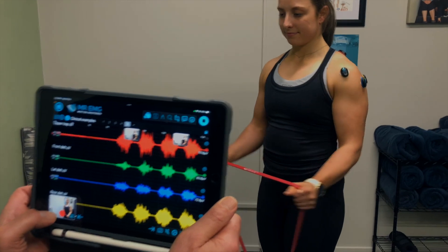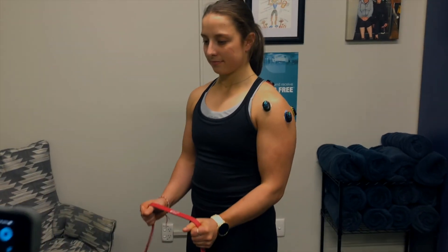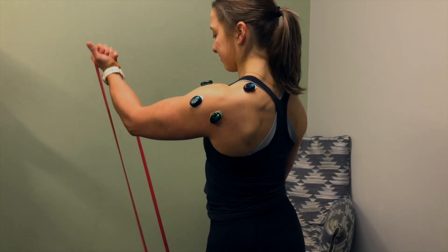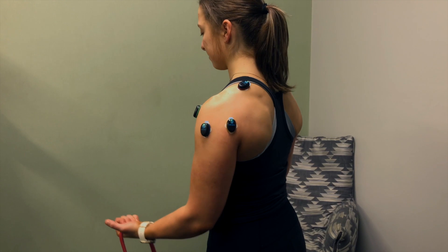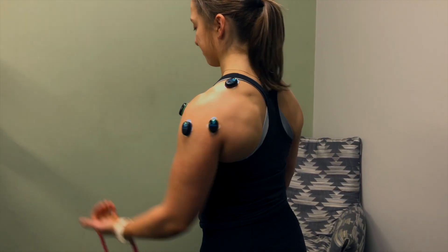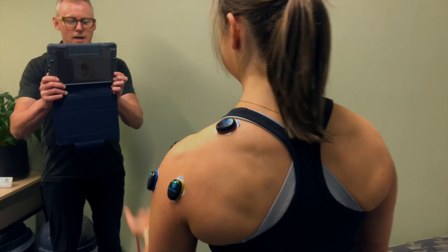To test anterior shoulder muscle functioning, have your patient perform 8 repetitions of resisted shoulder flexion. Observe the muscle amplitudes during the recording.